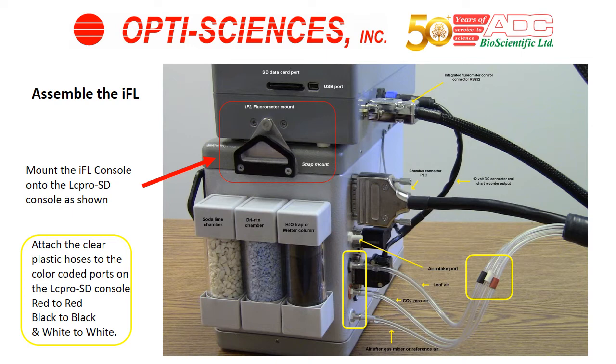If they are not mounted, remove the Phillips screws inside the red square, and put the IFL mounting brackets in between the strap mount and the console, and screw the screws back in. Then use the thumb screws to mount the IFL console on top of the LC-PRO SD console.